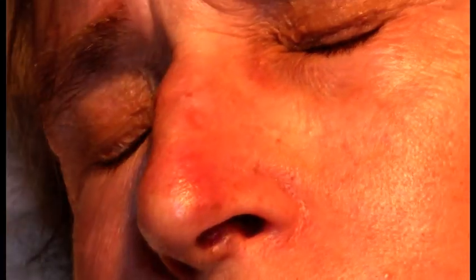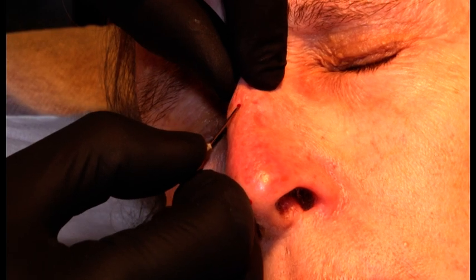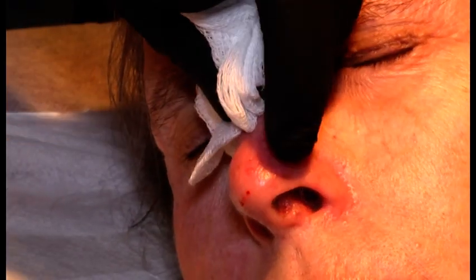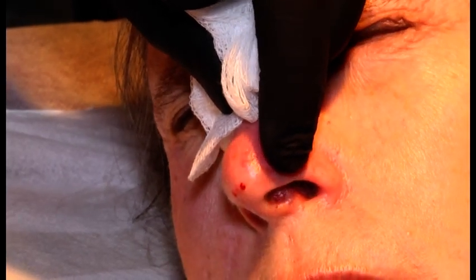I'm so sorry. Now, when I do this at home, I often also use a 25 gauge cannula, but just to emphasize the extra safety precaution, I use a 22 because it's more difficult to get into a vessel than the 25.